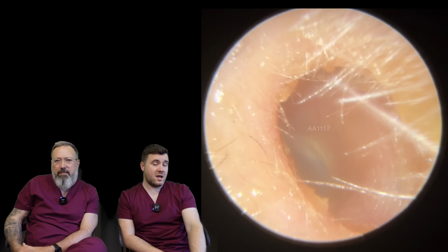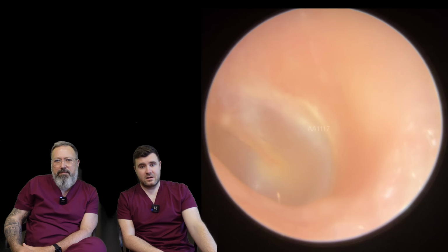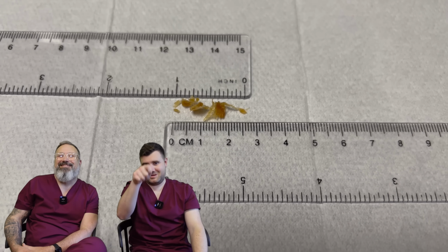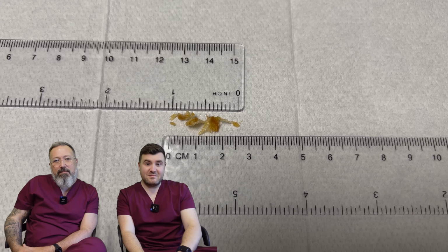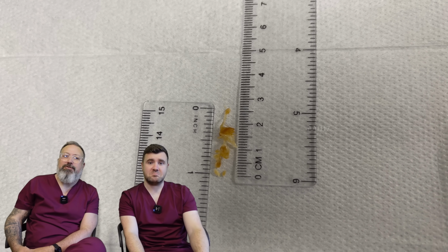Anyway, we're almost done. It's coming away really nicely. Eardrums looking lovely and clear. The patient was talking to me a little bit there, so that's why I was going all over the shop. It's not really much there, to be honest. Well, we got 2.5 centimeters. Bang on an inch. There we are, guys.